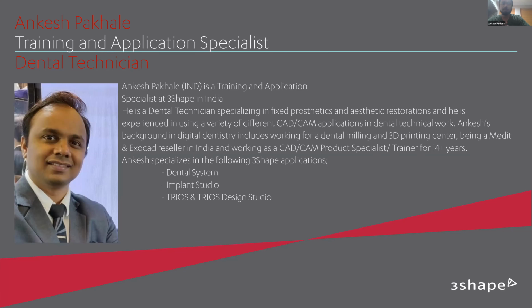I know a few other software as well, like Dental Wings, ExoCAD, and from the CAM division. From the printing aspect, machines like Envision Tech, Formlabs, and a metal sintering machine, EOS, Electro-Optical Systems from Germany. Right now I'm working as a 3Shape application specialist, looking after dental systems, Implant Studio, Trios, and its add-on modules like Design Studio and other add-on modules.